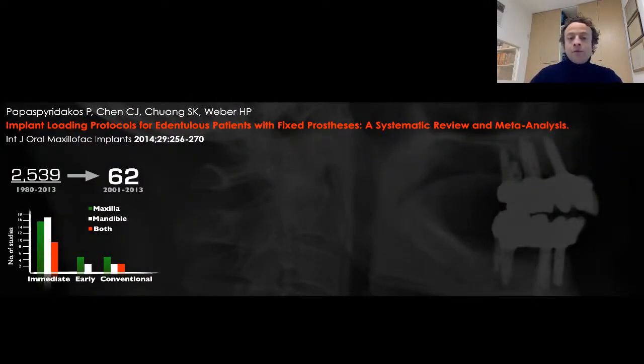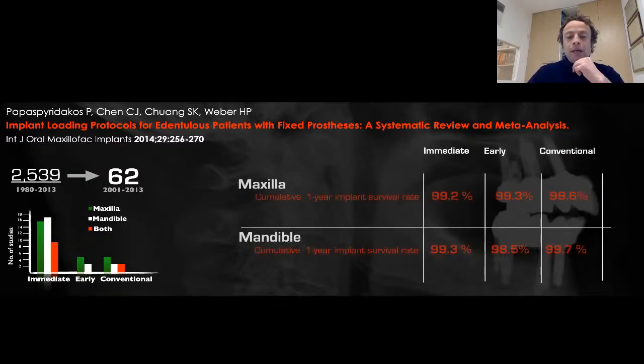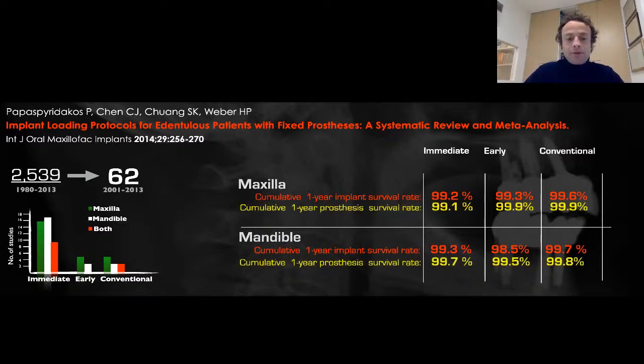And of course, in 99% of my patients, we work with immediate loading, because both in the upper and in the lower jaw, today we know that immediate loading has really amazing results that are comparable to early or conventional loading. Okay, so in particular, if we speak about survival, the results are absolutely similar. Of course, this is a study that considers only fully edentulous patients.